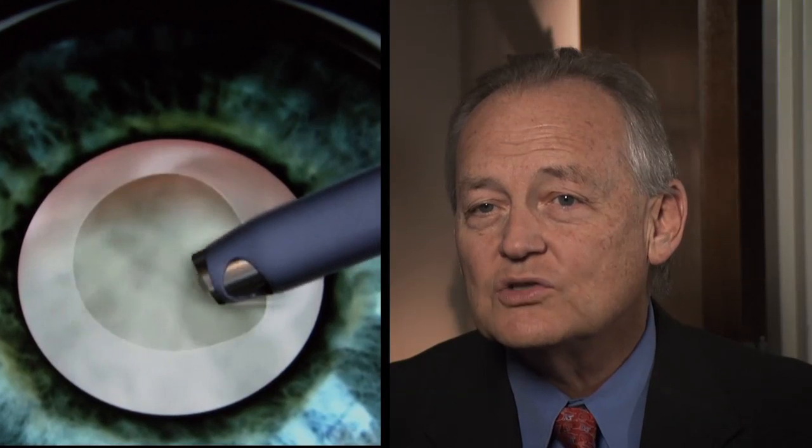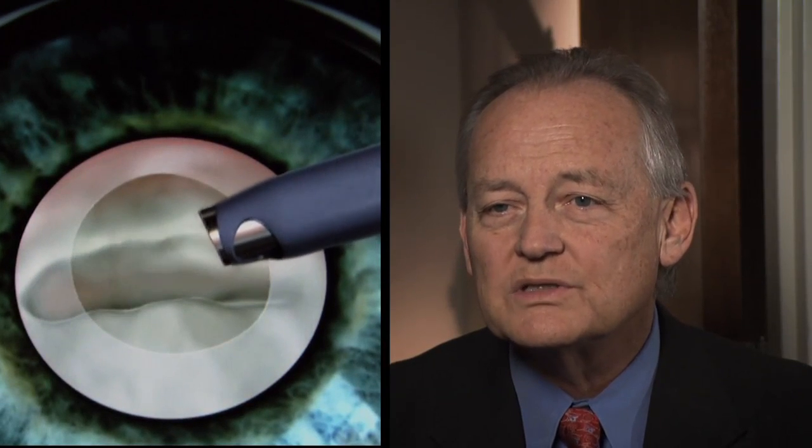When we do the cataract surgery, we make a little incision — 2.4 millimeters on the side of the eye. We make an opening in the candy shell, we suck out all the chocolate, and we leave the rest of the candy shell behind. All of that through a 2.4 millimeter incision. We fold the intraocular lens, slide it in through that incision, and put it back in the candy shell, or inside the bag as we call it.